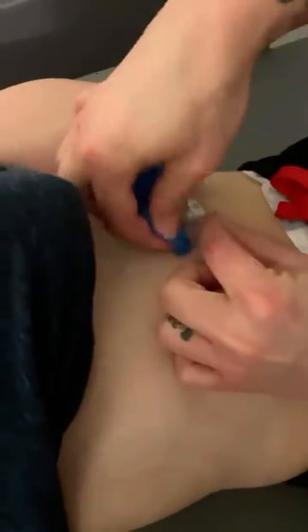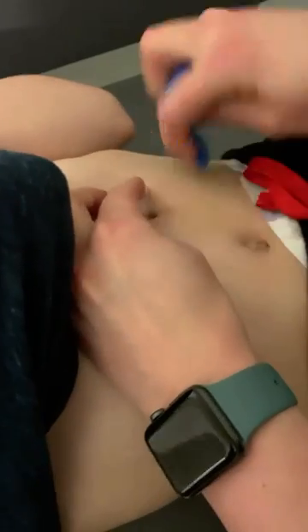So I did have some barrier cream on here yesterday because it looked a little red, so I'm just making sure I'm getting all of that off. And I don't think I need to put it on again.